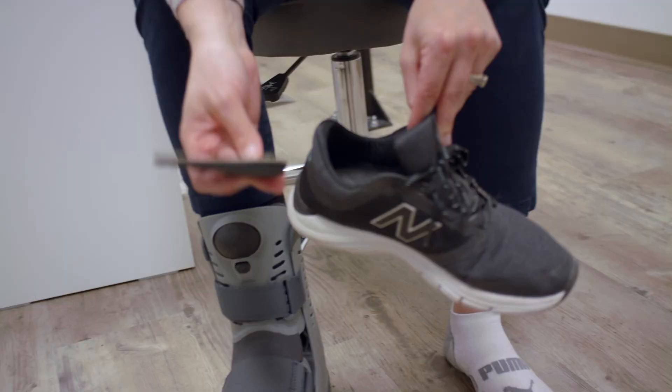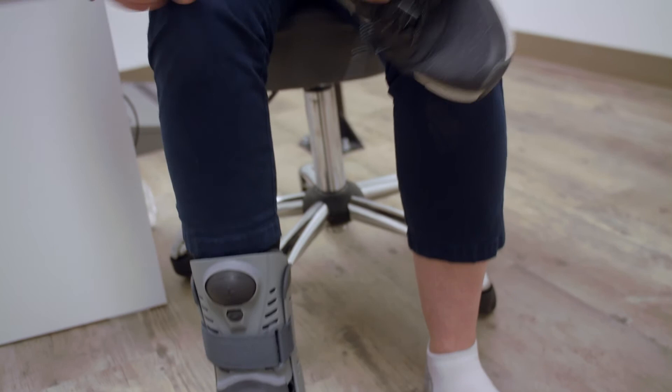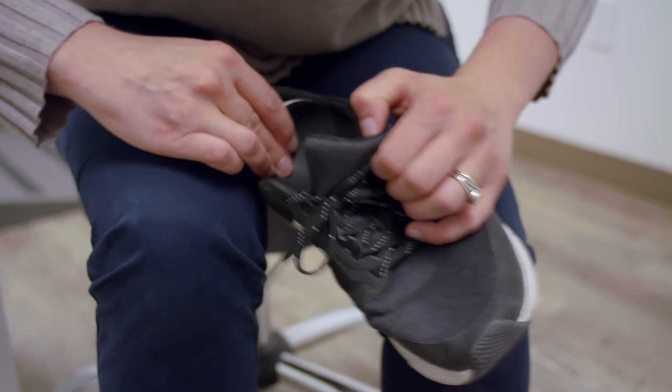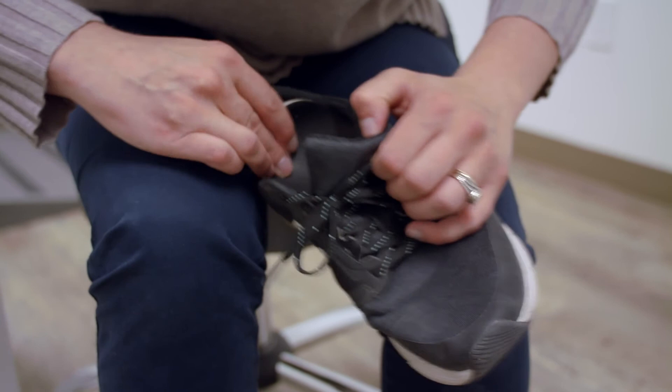Always make sure that you have a shoe that will work because this boot is quite high. So with this boot, I will put a lift right into the heel of my other shoe, under my orthotic. Put the heel right to the back, put this on, then put my shoe on — and you're good to go.